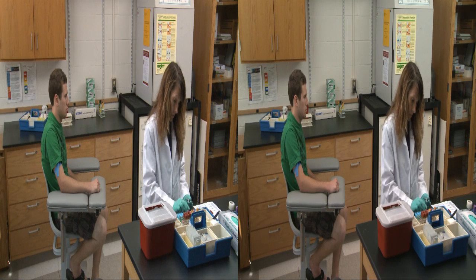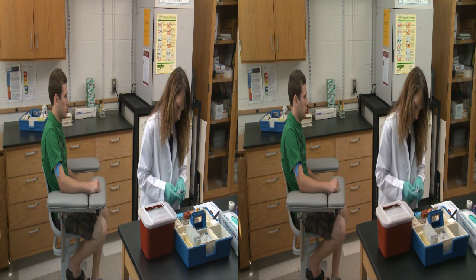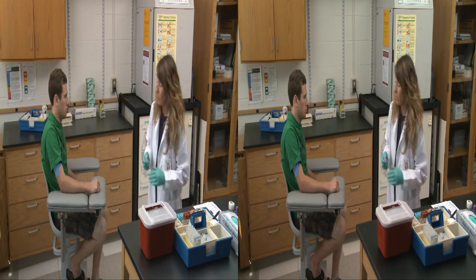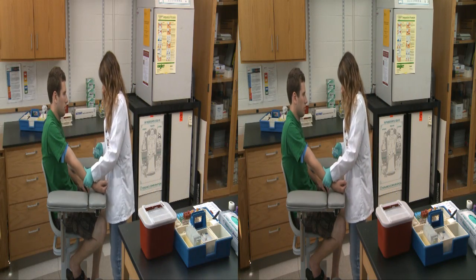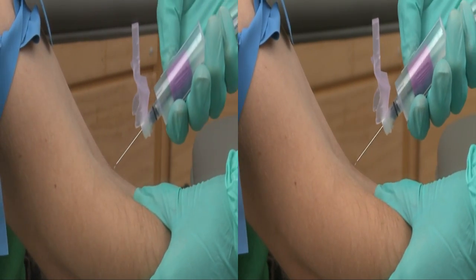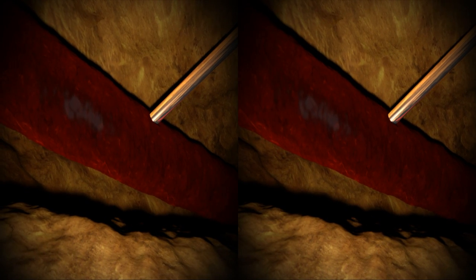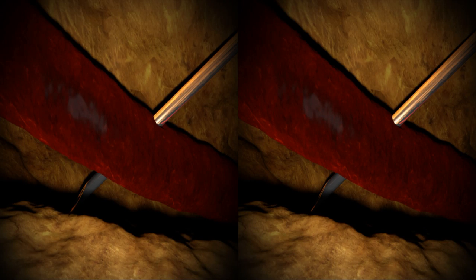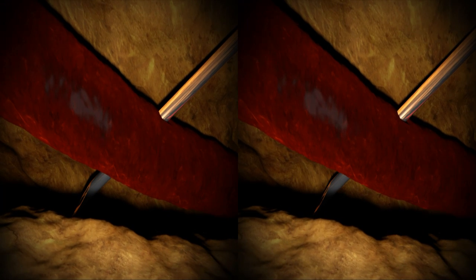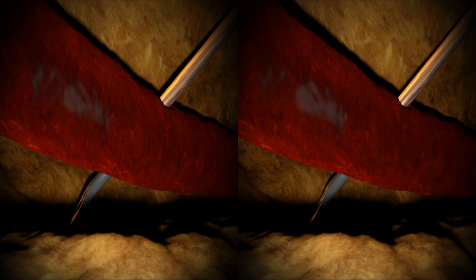Failure to align the needle perfectly with the vein and failure to insert the needle at a 30-degree angle can result in the needle missing its mark — poor technique that will require an unwelcome second needle stick. Inserting the needle at too steep or too shallow an angle and not lining up precisely with the vein are two common reasons for missing the vein. To the patient, that usually means only one thing: further anxiety and discomfort.